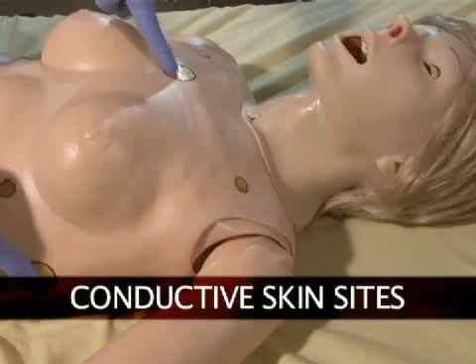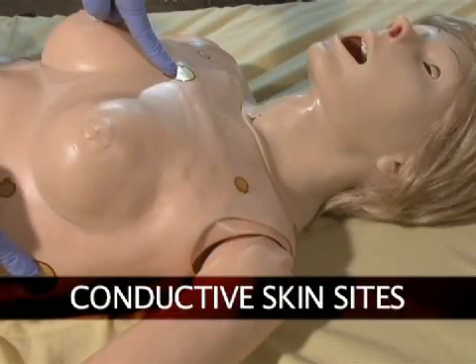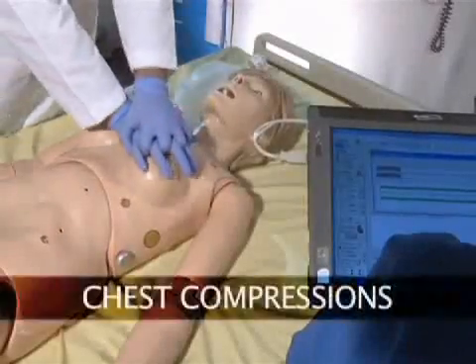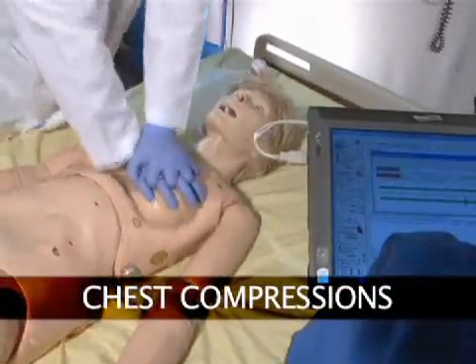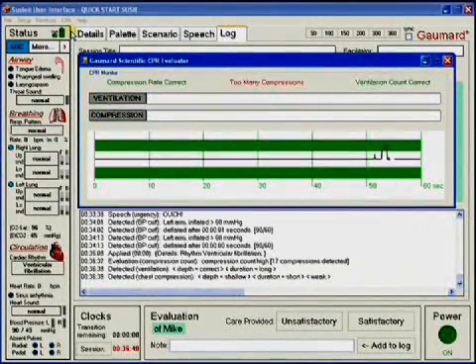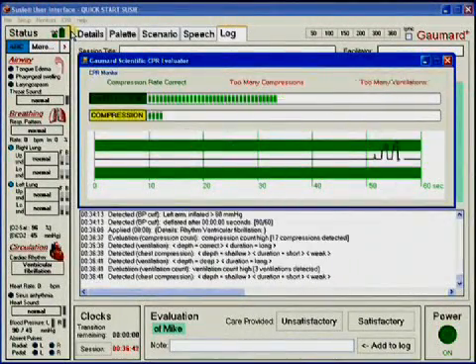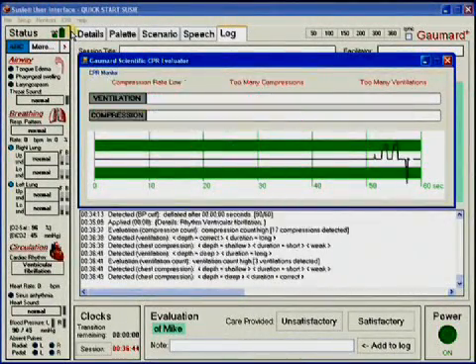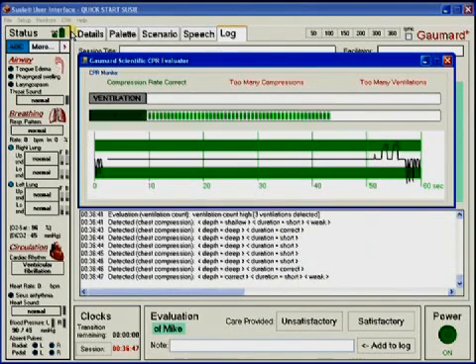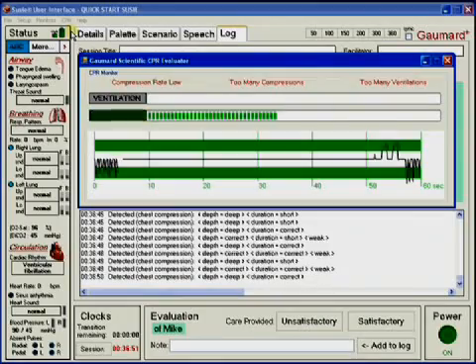Suzy's conductive sites are conveniently placed anteriorly to allow easy access for pacing. Chest compressions are measured and logged, showing the instructor exactly how students are performing. A full CPR sequence can be done with Suzy, and providers will be automatically evaluated on different aspects of compressions and ventilations, such as rate, strength, and ratios.